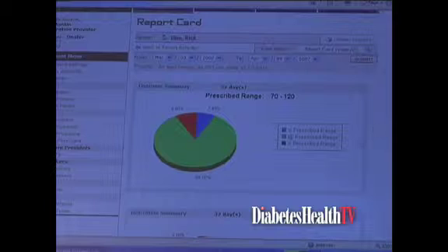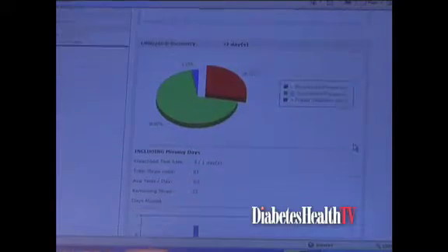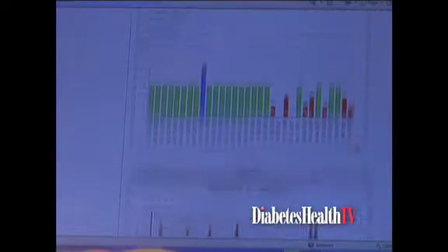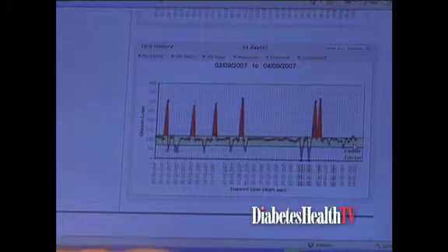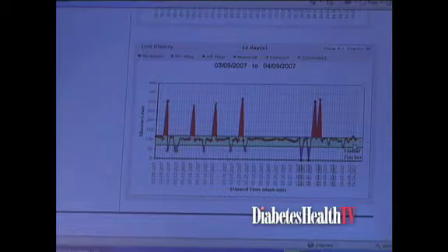And what's next? Once the information gets into our server, I'll show you some of the graphs that we look at. Everything's archived indefinitely, so you can go back and look for trends and patterns over the last year or the last quarter. If you're feeling dizzy, or you call the doctor's office, your healthcare professional can get online and see what's been happening in the last few days to better understand the episodes.